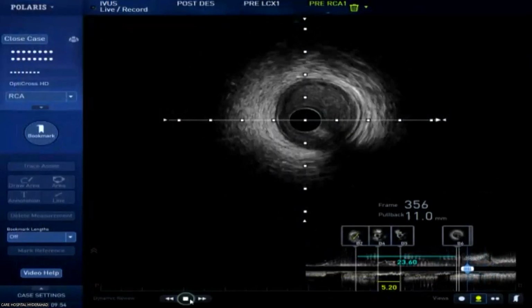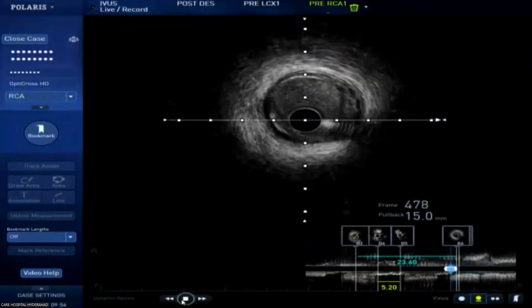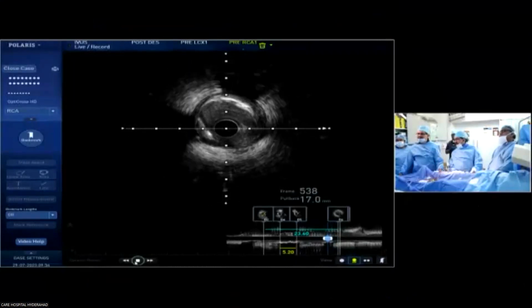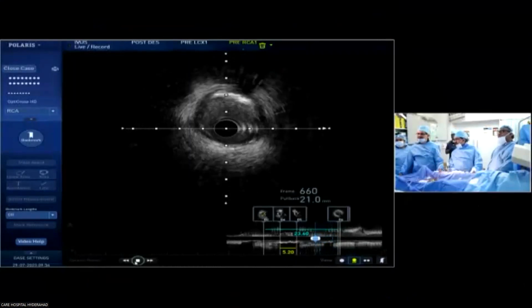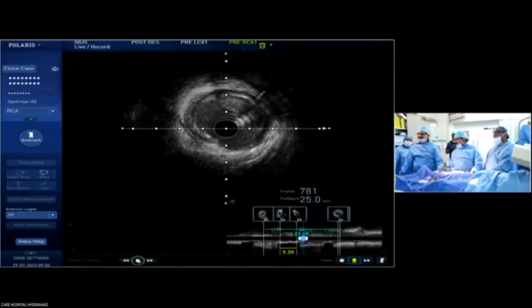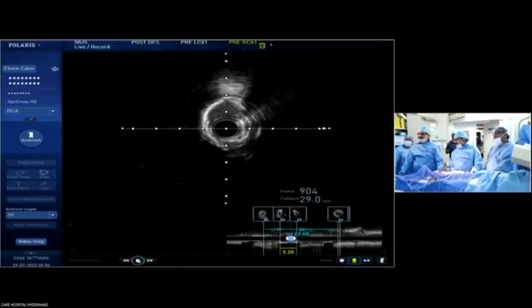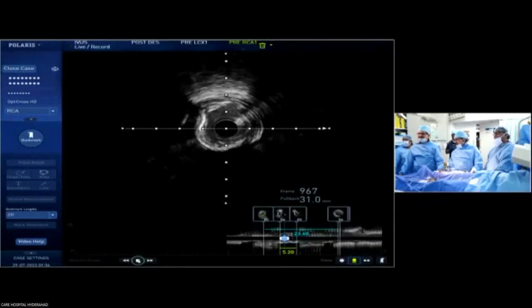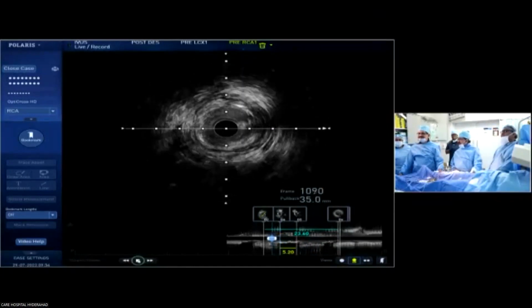We see a relatively diseased segment, with distal diameter of around 2.75 and proximal around 3.2. So there is calcium, but at the site of the CTO there is very hardcore intimal calcium. There's an arc of about 180 or so degrees of calcification. There are discontinuities within the calcium.